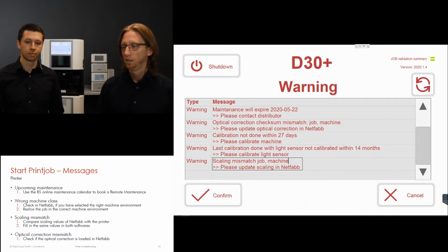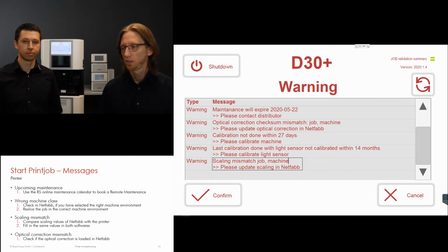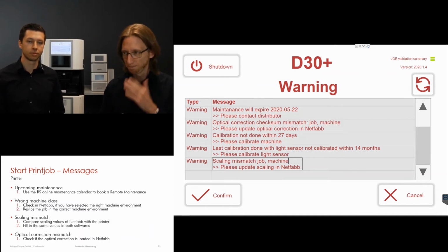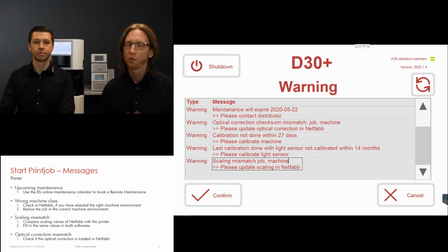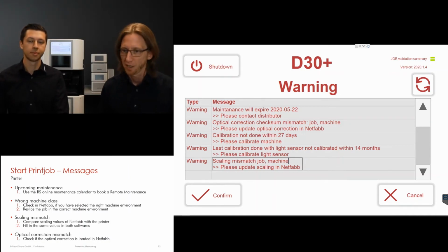And what does it mean? If you just confirm and start the job, you can be sure that the part will not be accurate in X and Y because the scaling is not correct. So just make sure that you have the same information in NetFab as on the machine, and reslice the job, and then it should be fine. By the way, the reslicing also applies to the wrong machine class. You can solve these problems by going back to NetFab, making sure that the settings are correct, and reslicing it, and then it should be fine.